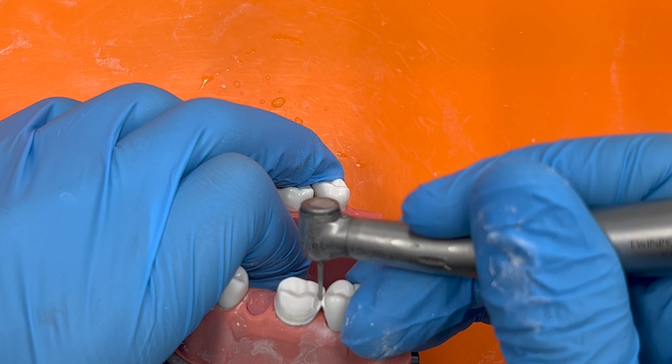Then I do the same thing on the cusps until I get 1 mm reduction all over the occlusal surface. My aim is to get more than or equal to 1 mm and less than or equal to 2 mm. Following that, I place the burr in the opposite direction and round the cusp tips.